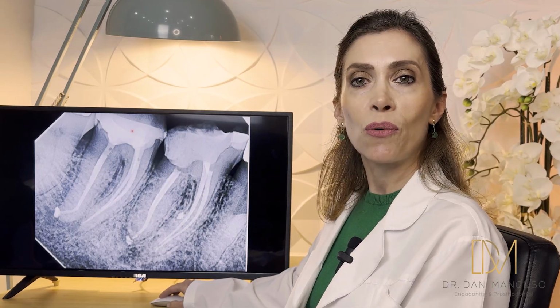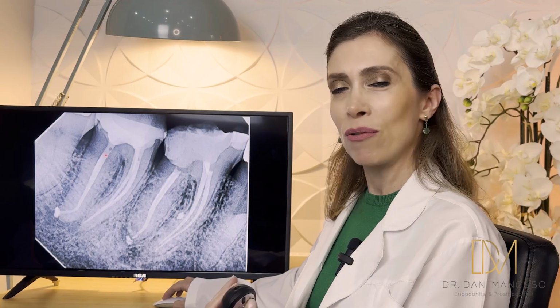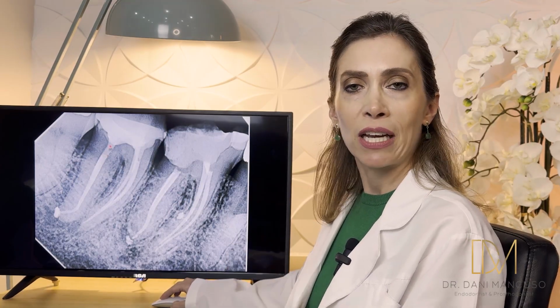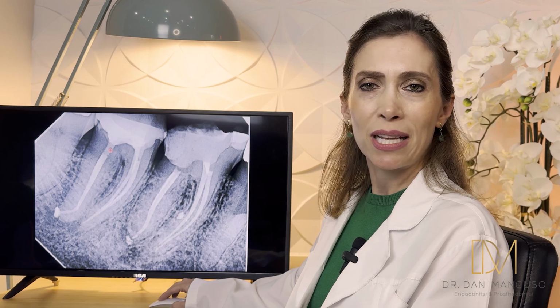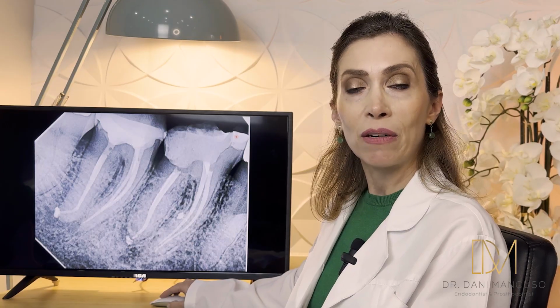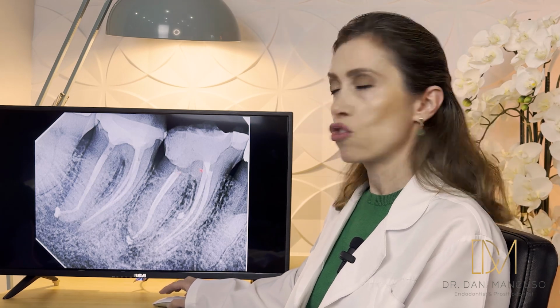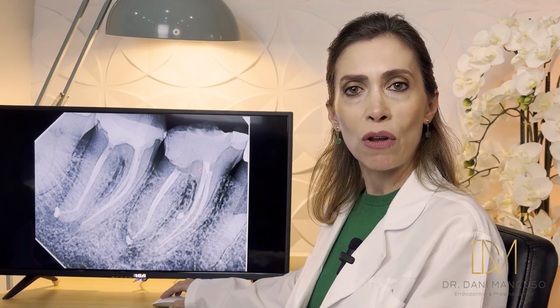Another important thing when you are doing your final core, if you do a composite core, is to make sure you go slightly deeper into the canal, about 2 to 3 millimeters deeper, so you can put the flowable composite before you bond your composite. There was a little bit of void here, but don't worry too much. That's fine. It will be strong enough. Both teeth will go for crowns. This is not the ideal core, so it will be replaced with a more solid one. But we wanted to finish the root canal treatment for the dentist to carry on with that treatment.